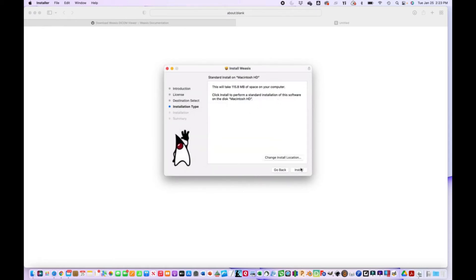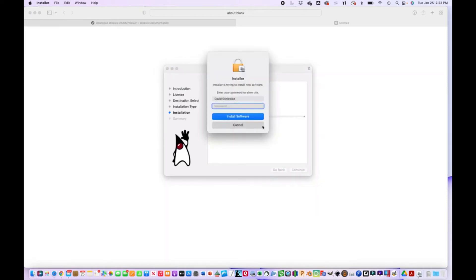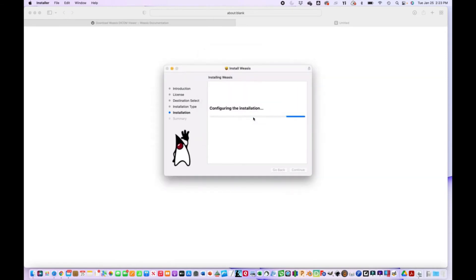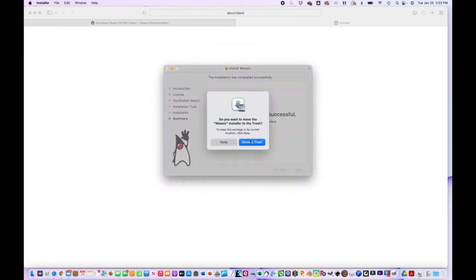Just go ahead and install. You may have to put in your password. Install. All right, and that's it.